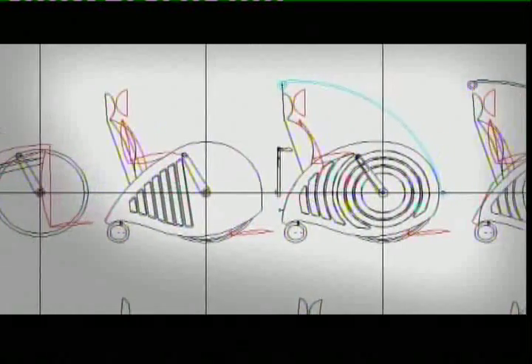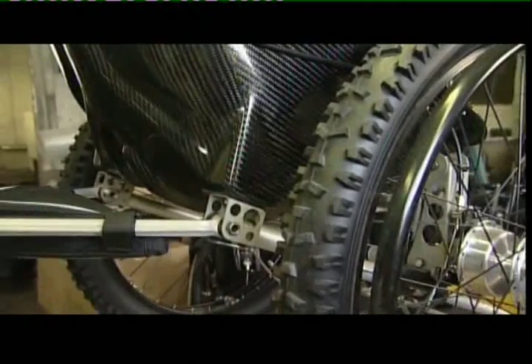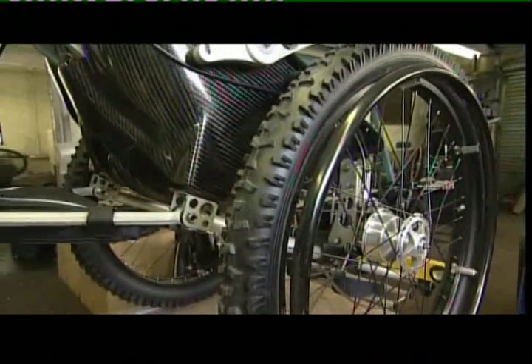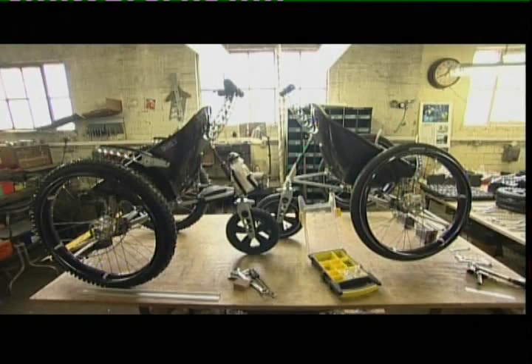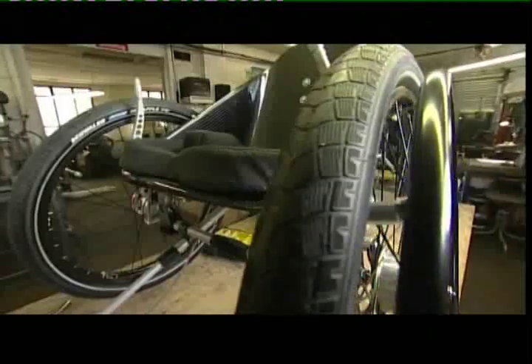If the TREKINETIC was going to be truly versatile, it needed to be 2 wheelchairs in one. It obviously needed stability, which would only come if Mike opted to widen the distance between its wheels, like you see on sports wheelchairs. But it also needed to have wheels that were lean enough to fit through doorways. Mike had to find a way that someone with limited movement would be able to alter the angle of the wheels to suit the environment they were in.